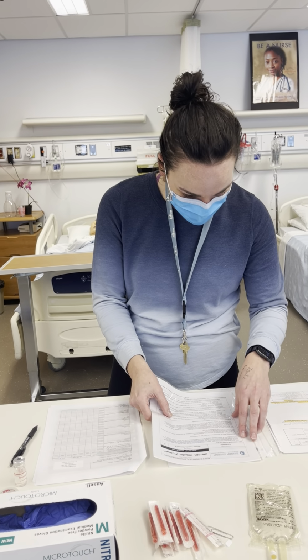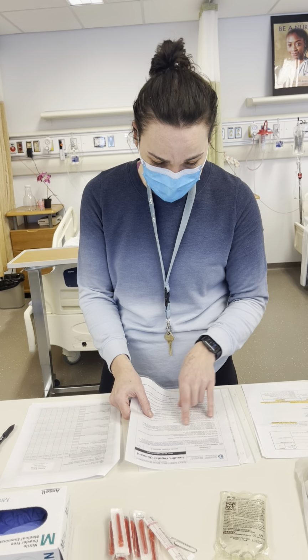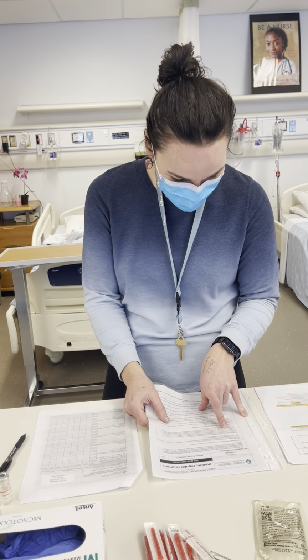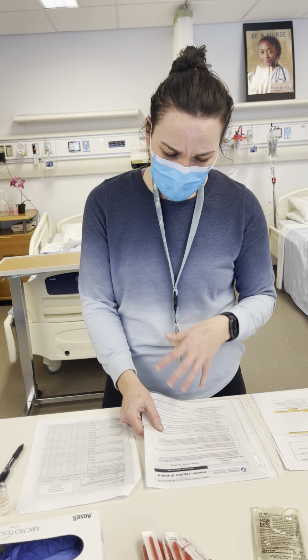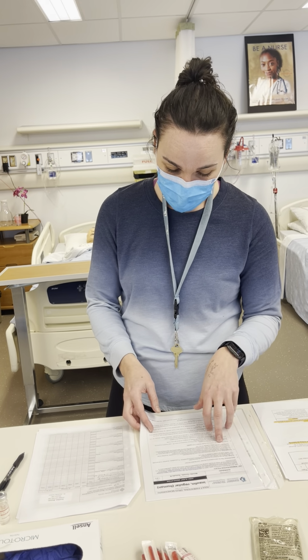So we'll go through it and we'll see IV continuous, maybe delivered by nurses or nursing students. It says minimum monitoring parameters. After the first dose, we do Q1H, and then once we're in the glucose range we want, we'll go to Q4H.